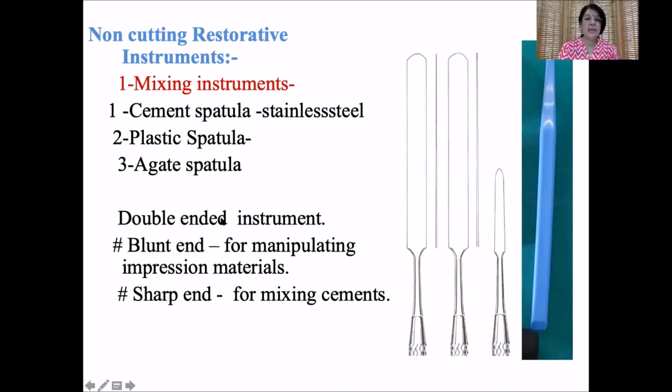These are double-ended instruments. The blunt end is used for manipulating the impression material, and the sharp end is used for mixing the cements.